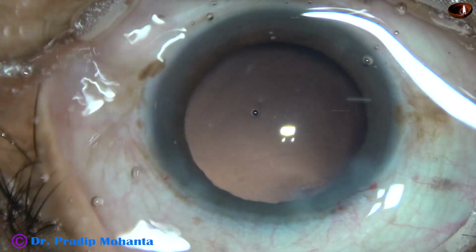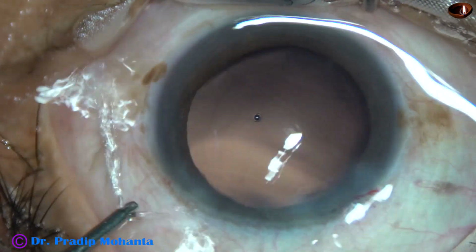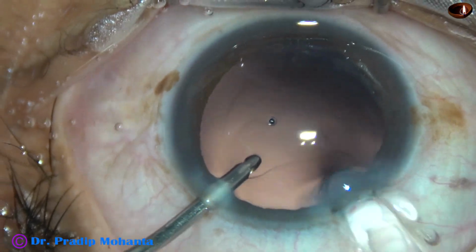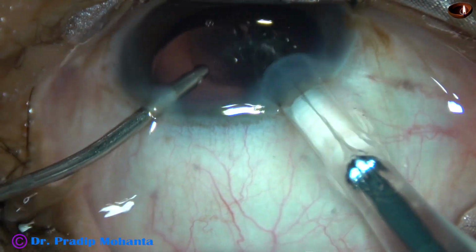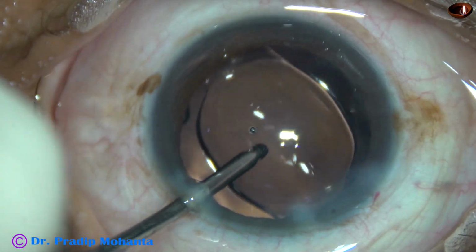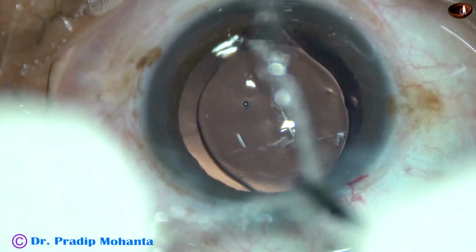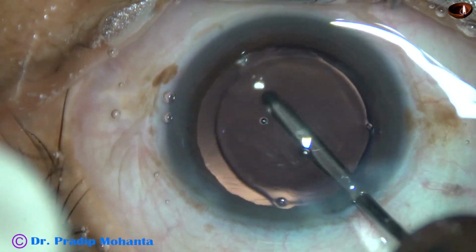In this case we are going to use a B cartridge to implant the lens, so I enlarge the main wound to about 3 mm. Now this is hydroimplantation of a single piece monofocal hydrophilic intraocular lens. The lens has gone into the capsular bag.